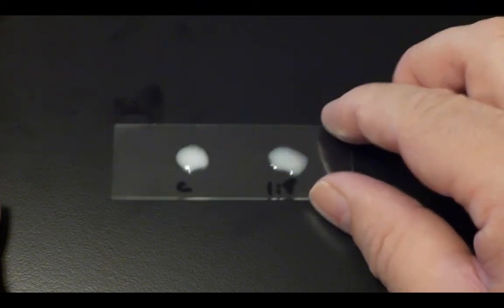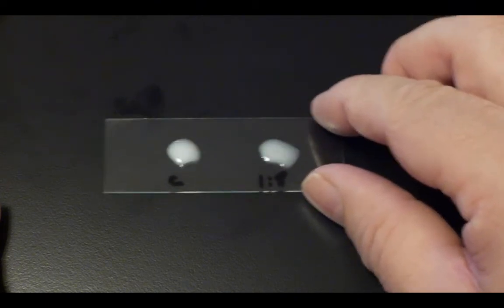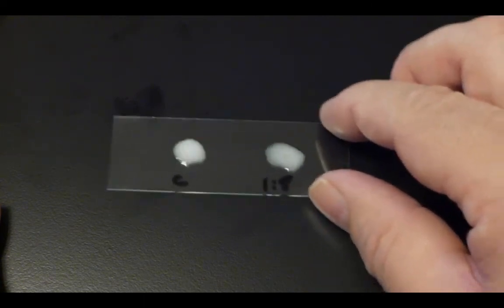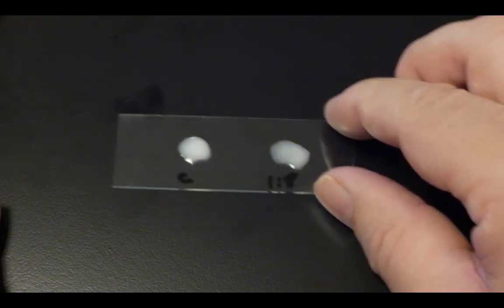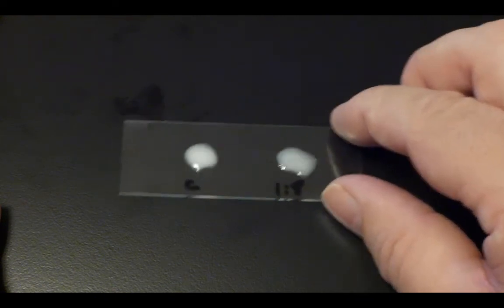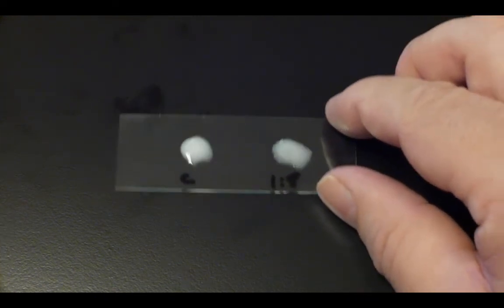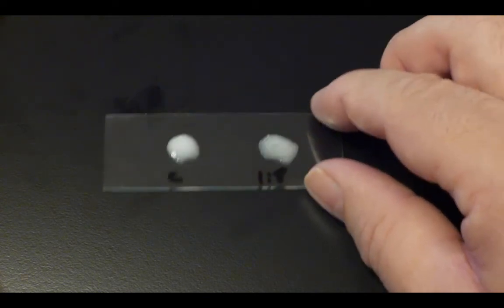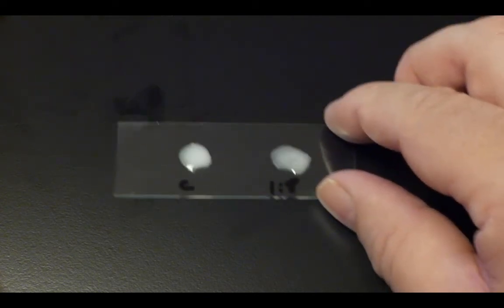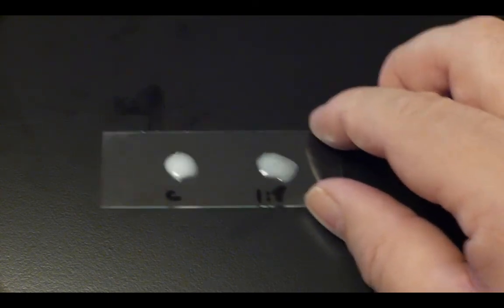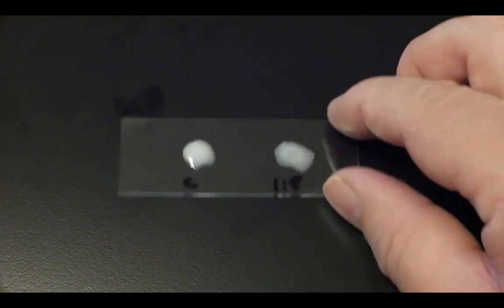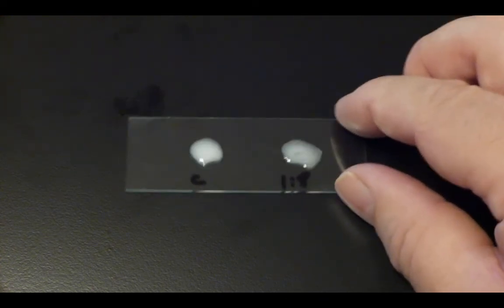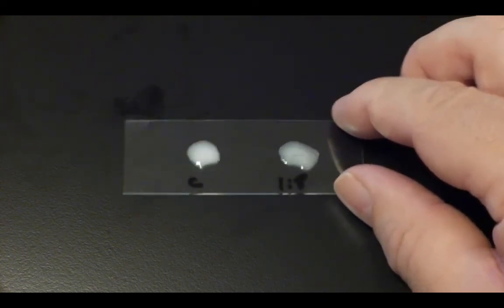As you rotate the slide you may start to notice a change in the two spots. If you look carefully you will see that the one on the left, C, the control spot, is remaining relatively milky. Whilst the spot on the right which is a 1 in 8 dilution of the antibody in this case is beginning to go a little clumpy. You can see a dark mark appearing in the centre of the spot.